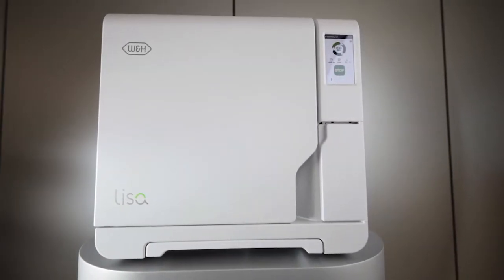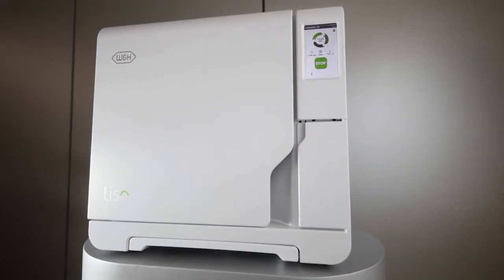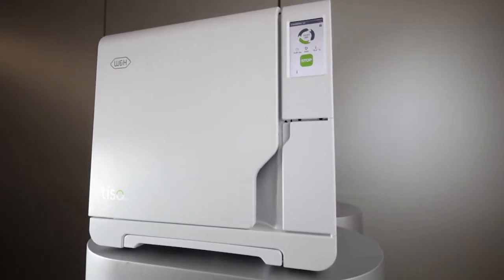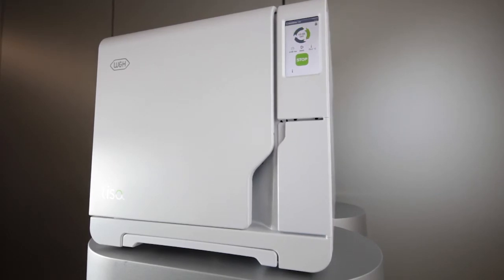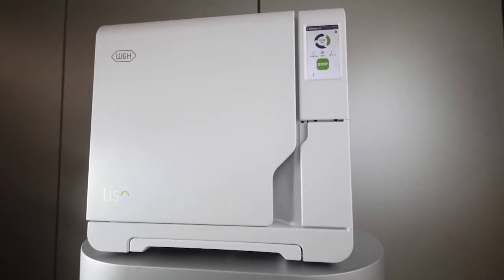Modern sterilizers are subjected to regular tests during their lifetimes. Because the W&H Lisa is a Class B vacuum sterilizer, an air leakage test must be carried out as described in the manufacturer's instruction manual and your National Hygiene and Decontamination Guidelines.